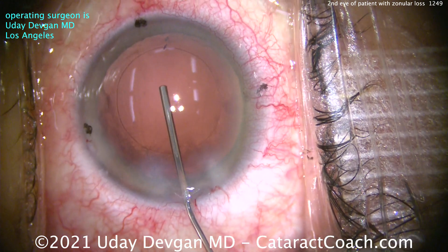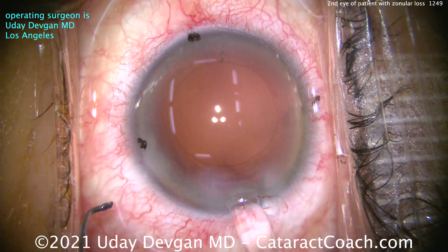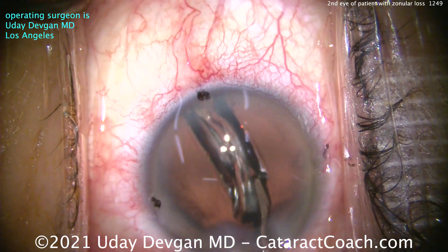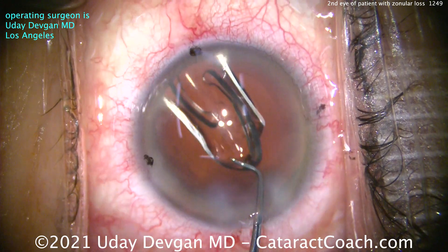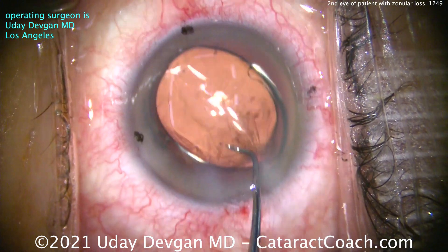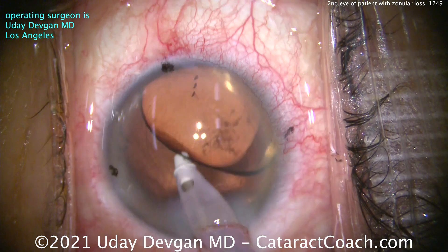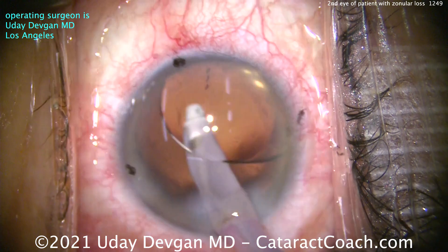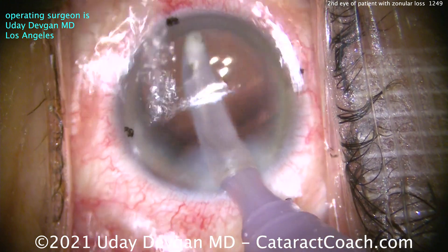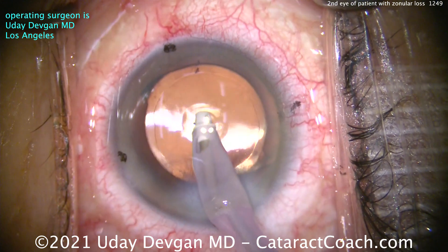One thing I'm going to do differently: fill up the capsule bag and be a little more cautious about capsule polishing. I still don't believe this is going to be 100% normal capsule, so I'm going to be super cautious. When we deliver the lens, I want to minimize manipulation and try to get it at the correct toric axis right off the bat. This patient — now a couple months post-op — had a beautiful recovery and fantastic visual results. But remember: results from surgery are 50% your surgical technique and 50% the patient's healing, the patient's tissue. Sometimes eyes don't respond the way we want them to.